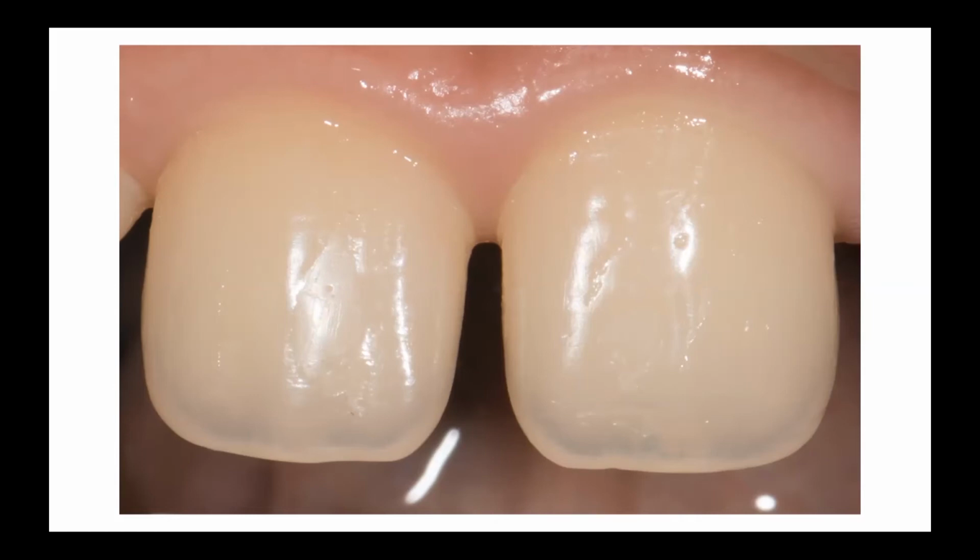Please look at the transparency on the enamel edge, and this transparency is hidden inside. So there is something like a transparent chamfer. And after that, this transparency is colored with a less transparent enamel layer. This is a natural distribution of enamels. And of course, we can see a very complicated structure of mamelons near the incisal edge and a strong halo effect.